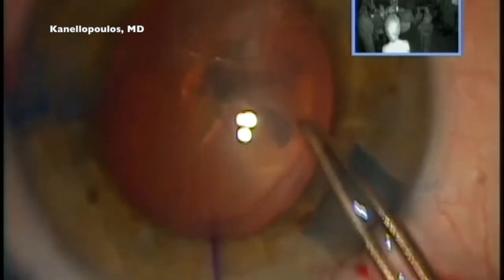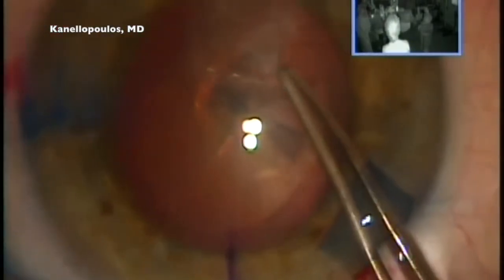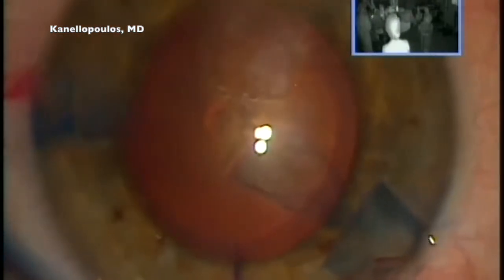But once I get a nice edge under my Utrata forceps, which I accomplish here, I can use the blue dye as a guide even through the very hazy part of the cornea to help me complete my capsulorhexis uneventfully. I was talking about my short-lived peribulbar anesthesia.